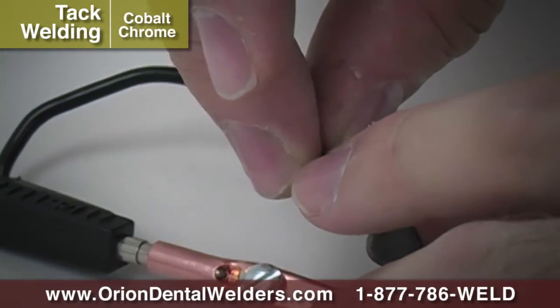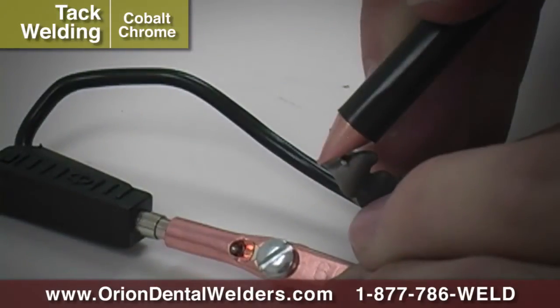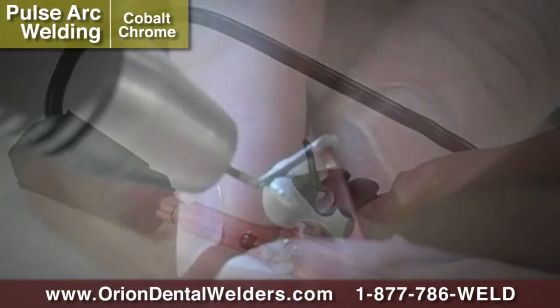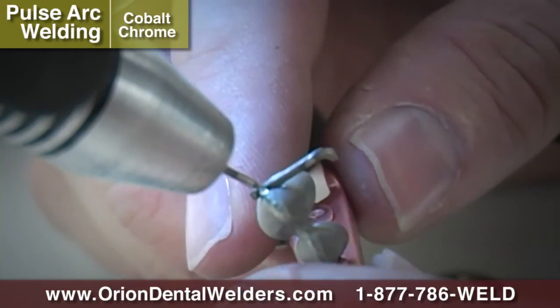Use Spot Mode and the Single Probe handpiece to temporarily place the sprue before Pulse Arc welding. The Orion is then used in Micro Pulse Arc Mode to create a seam around the sprue.